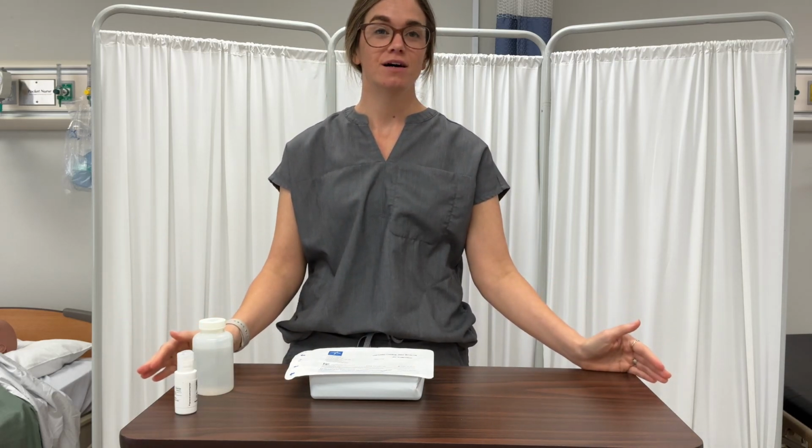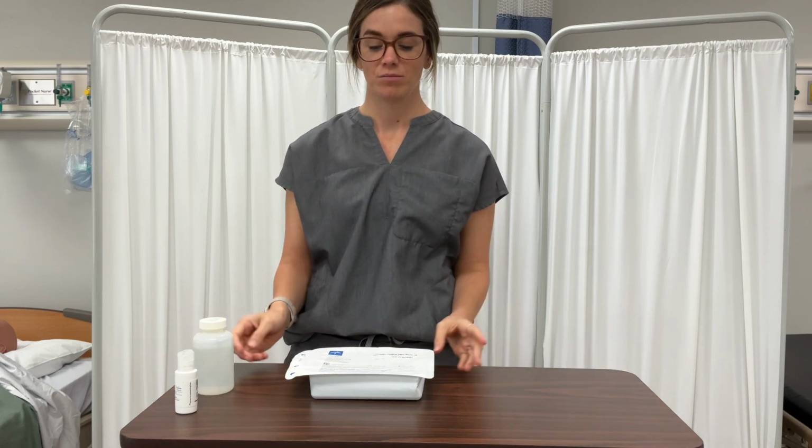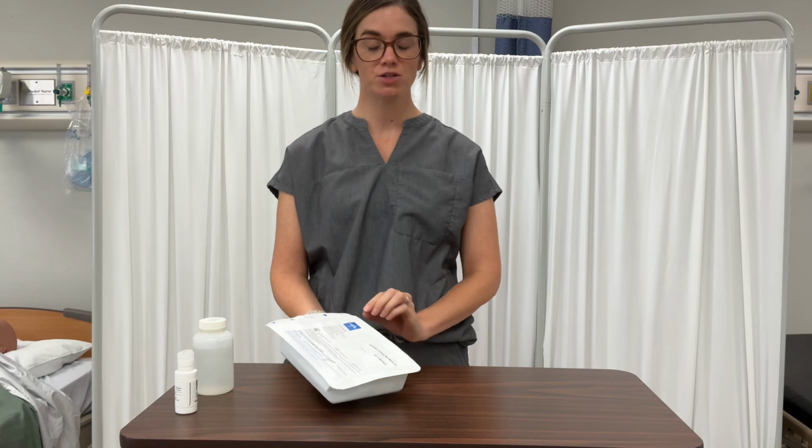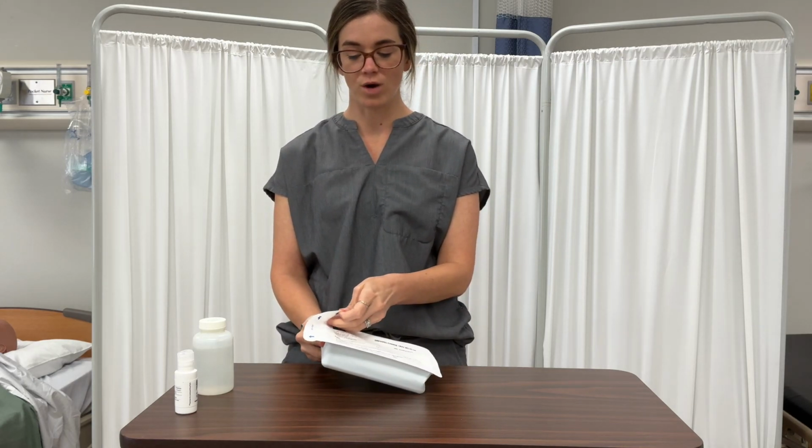Make sure your bedside table is also clean. Just because it doesn't appear to be dirty does not mean it is clean. Please wipe it down before you start. All right, so the first thing I'm going to do is open up my sterile package. Remember, we have our 1-inch border.